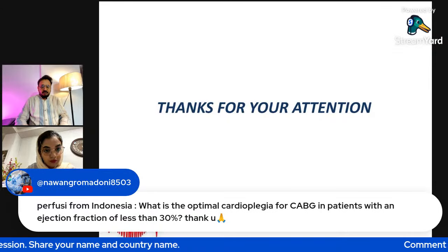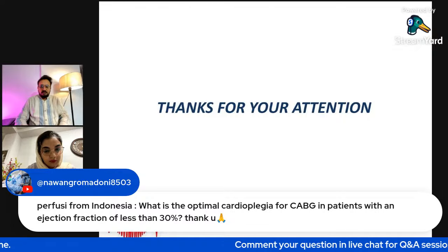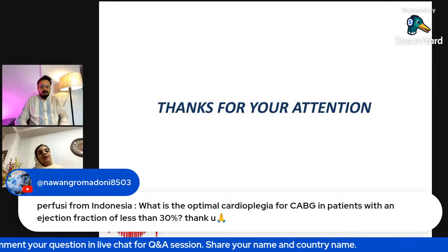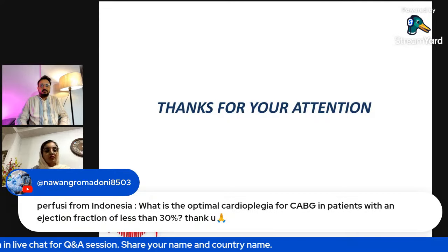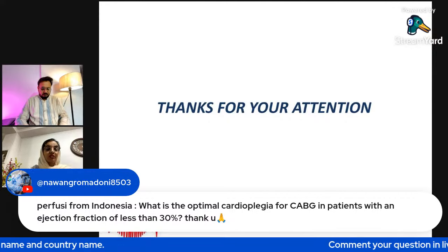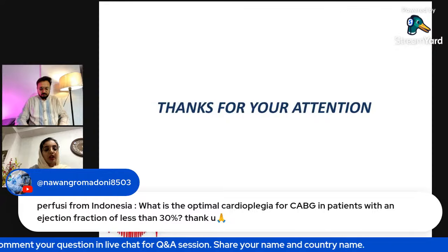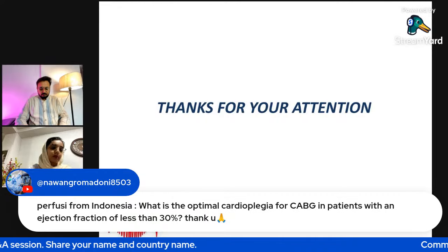Okay, we have the next question. What is the optimal cardioplegia for CABG in patients with an ejection fraction of less than 30%? For low EF, it's better to use warm cardioplegia, and blood cardioplegia is very good for them because they have low EF, and we should inject cardioplegia that reduces the risk. I think blood cardioplegia is much better for them.